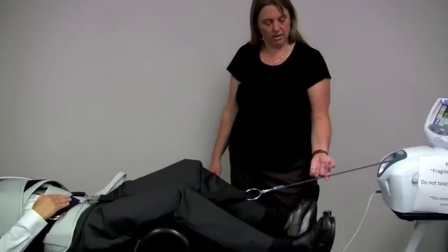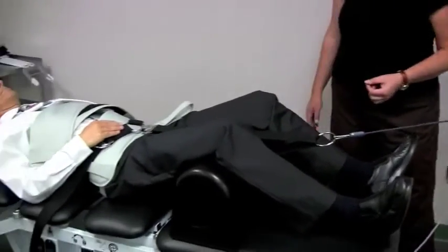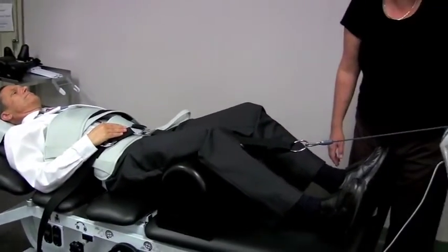It's down to 20 pounds. And it's going to be a faster, not that slow progression. It's going to go fast into this next one. And we're almost at the bottom, finished part of the down phase, that weight hold part. See how it pulled kind of faster than before. So increasing it to 100% is fun.